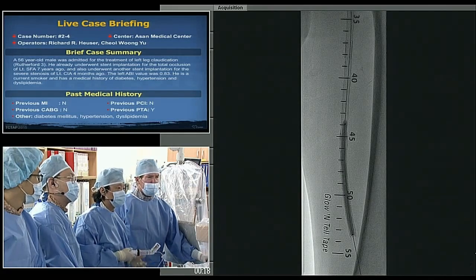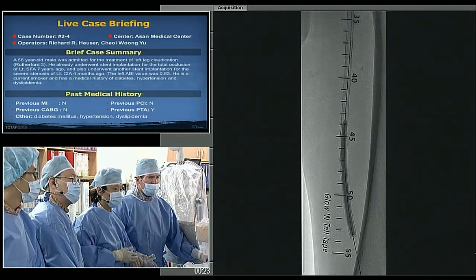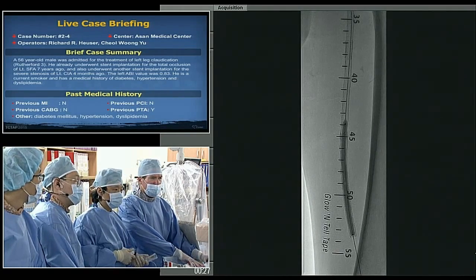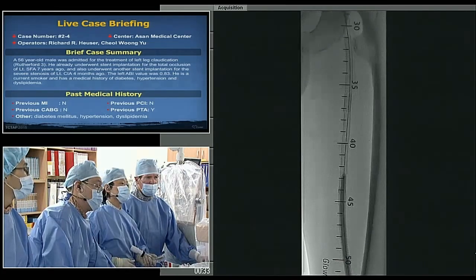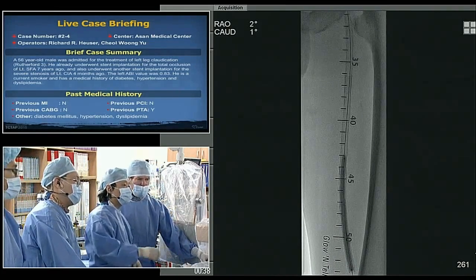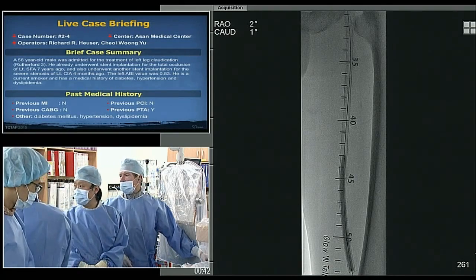So let's pan back here. I wonder how many we're going to need. I was thinking just 2, but I think we're going to need more than that. Pan back. Let me see the numbers. Pan back, please. So I think we're going to need 3. Don't you think? 6 by 120s. I don't think we're going to get it with 2.